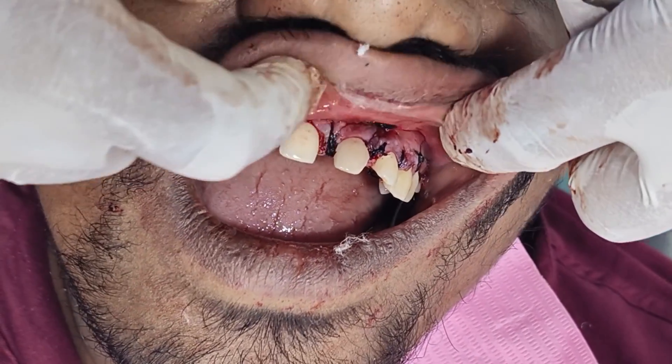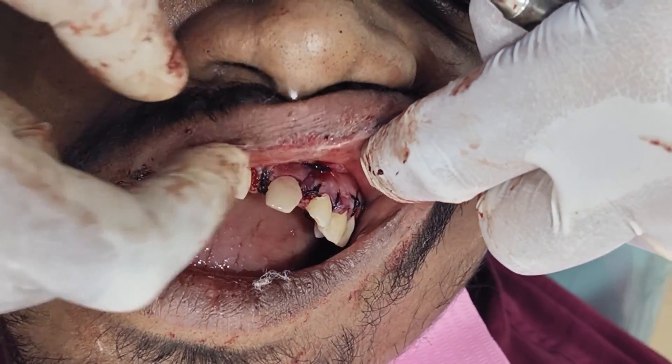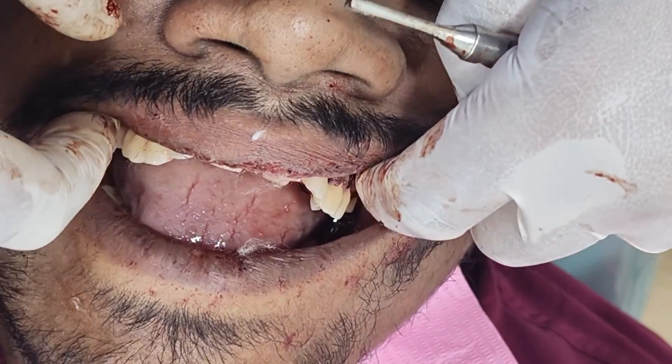Now we are done with the suturing and the cyst is removed. Hope he recovers very soon.